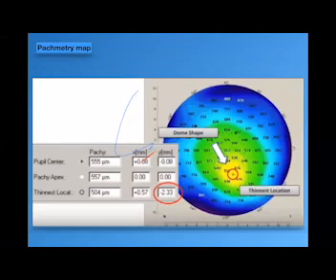But the inferior steepening in one eye could make us suspect early keratoconus in that eye, because of the correlation between both eyes together. If we check this eye separately, we will consider it a normal eye, okay?